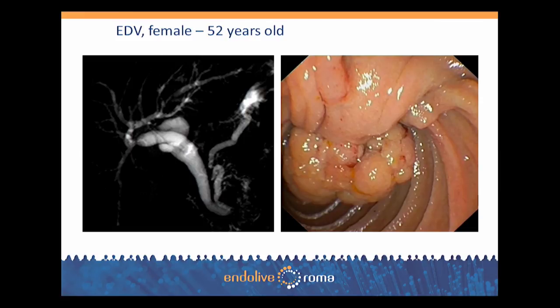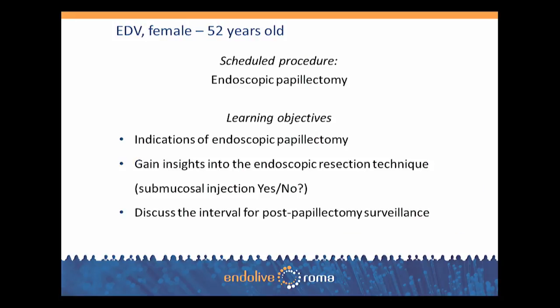MRCP shows dilation of the common bile duct at 14 mm in diameter, main pancreatic duct at 6 mm in diameter, and upstream biliary dilation. At the site of the ampulla of Vater, we can see a filling defect corresponding to the ampulloma just mentioned. The scheduled procedure is endoscopic papillectomy.